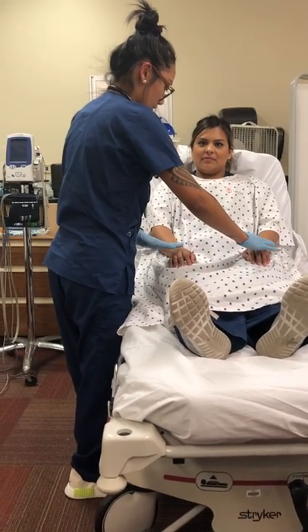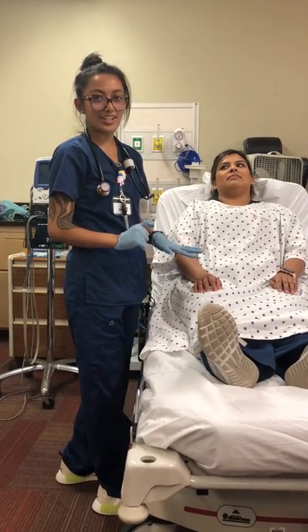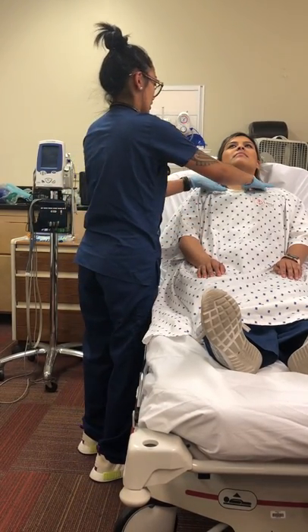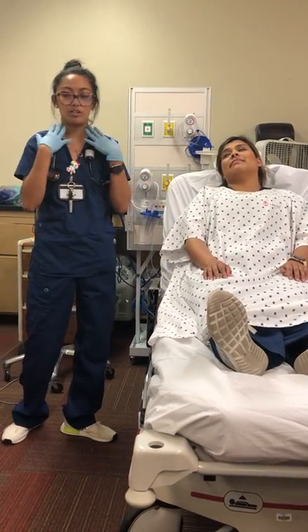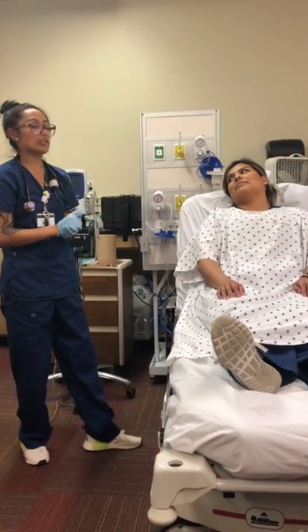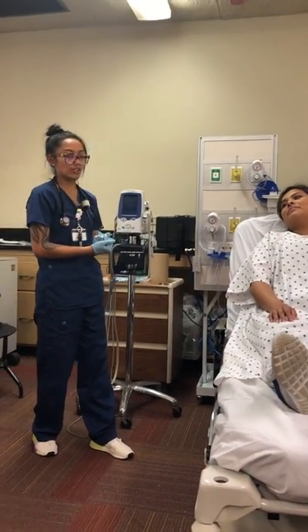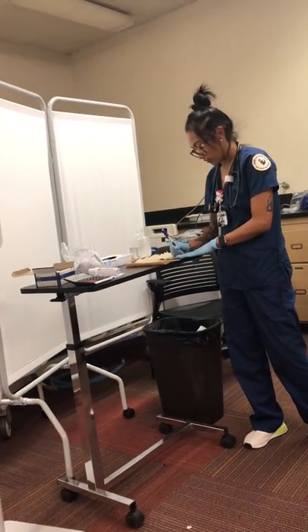Her skin is warm to touch and her digits are fine — there's no sign of cyanosis. There's also good coloration. Are you having any trouble breathing? No. On a scale of 1 to 10, would it be 0 that you're breathing fine, or a 10 that you're having a hard time? Zero. So there's no sign of dyspnea, and she mentioned that she's okay.